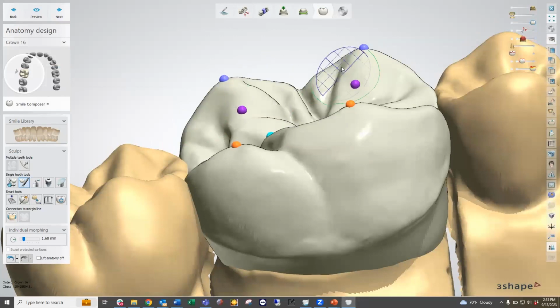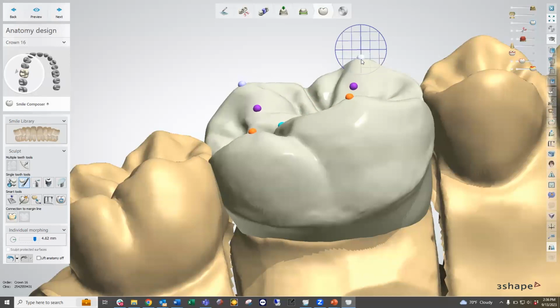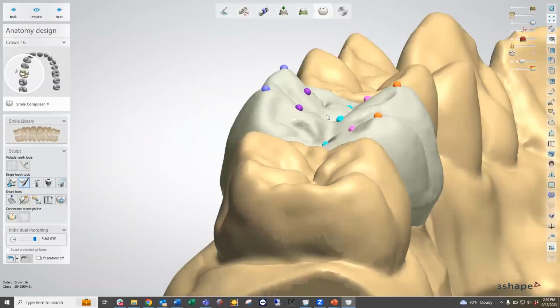Okay. Now, if I wanted to get a little bit more accurate, I can do a smaller circle with the shift and the scroll wheel. And again, using that contoured edge allows me to redefine our design as we see. Now, if I went too far with my ridge, and I wanted to keep all those changes that I just made relative to the profile of the cusp ridge, I could hold the shift button and make my scroll wheel bigger to encompass the whole cusp shape and then just drag that down. So it allows me to keep the profile that we just made without losing any of our design.